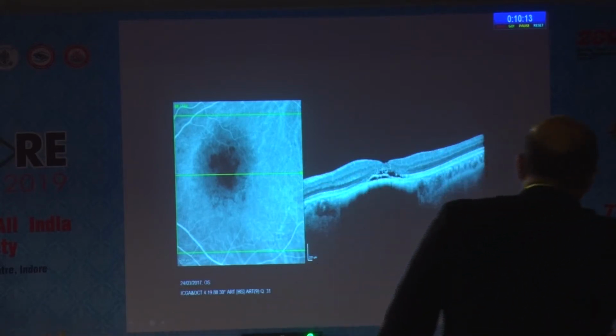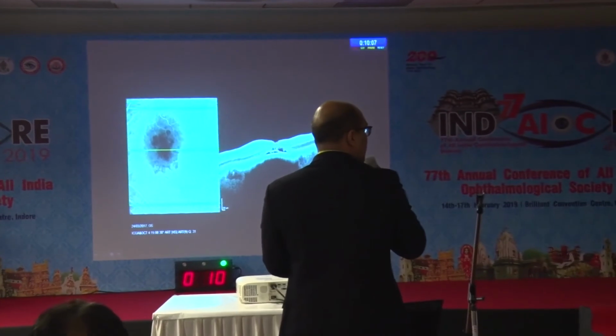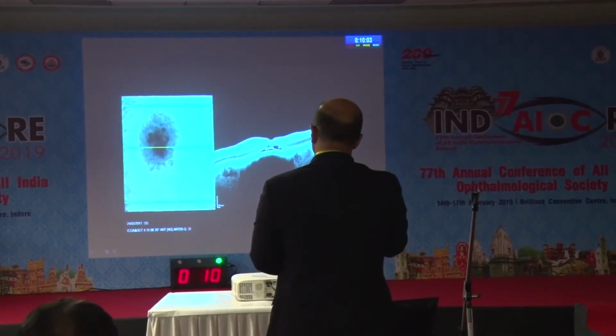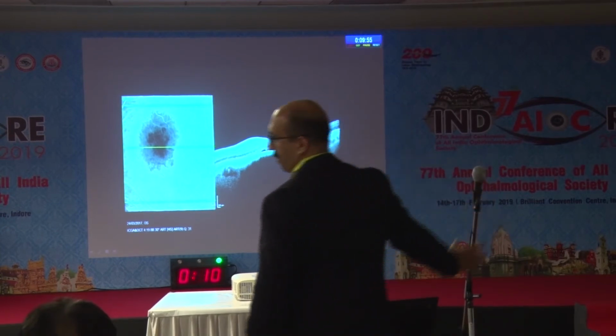So, yeah, Shane, please. Many times I've noticed that some of the occult membranes don't highlight on ICG, and you might pick it up on OCT and you treat it and it responds, but it will not be evident on ICG. Okay. So, Dr. Anand, are you wishing for an OCT angiography now?